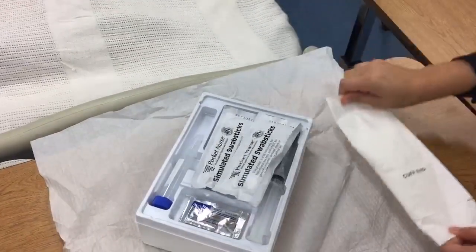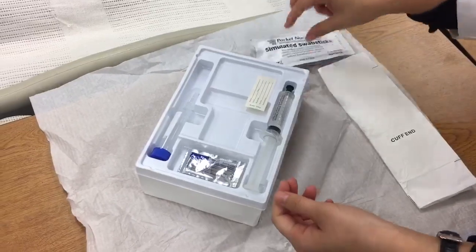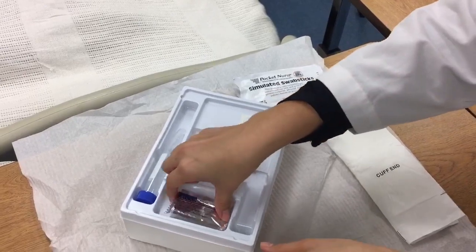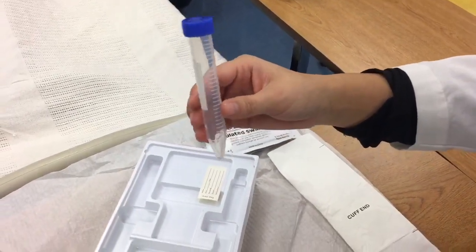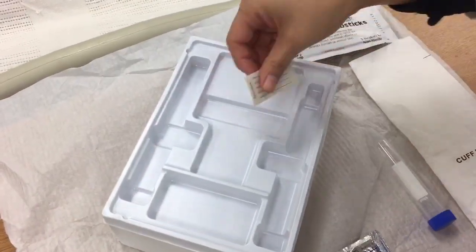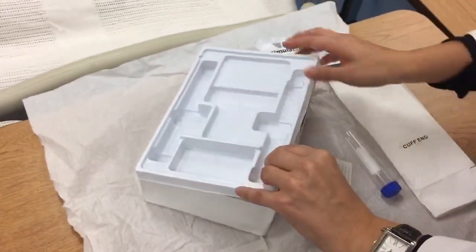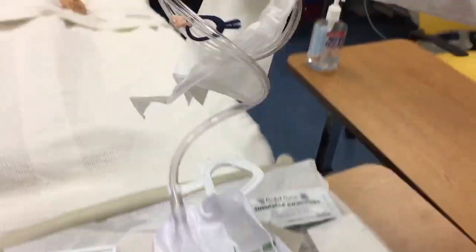Sterile gloves, swab sticks, sterile water or saline, gel, tube to collect for urine sample or specimen, label, Foley catheter.